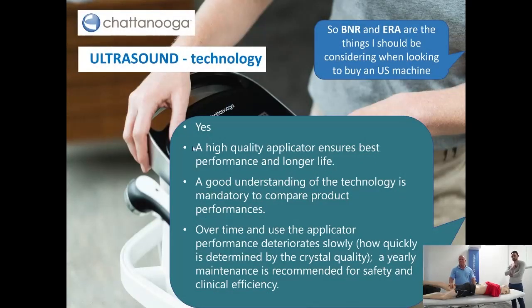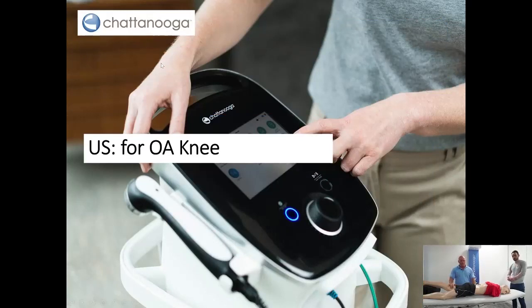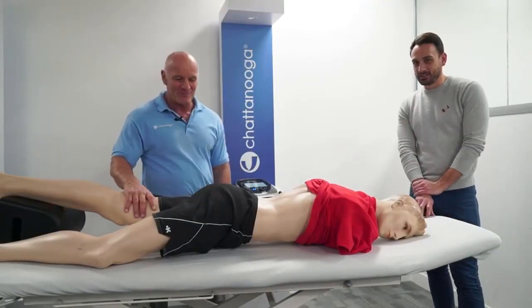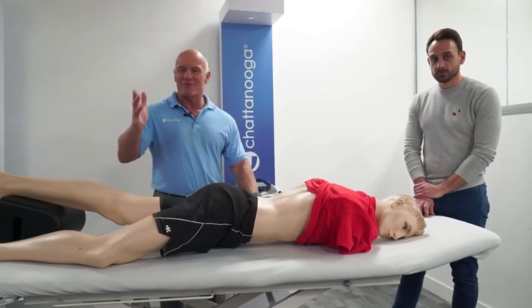Okay, so why don't we look at an example of using ultrasound for osteoarthritis in the knee. I know it's an area I get lots of OA patients in my clinic. Definitely an area of interest. Okay, so let's have a look at the parameters we use.